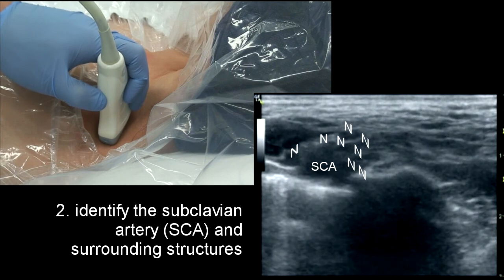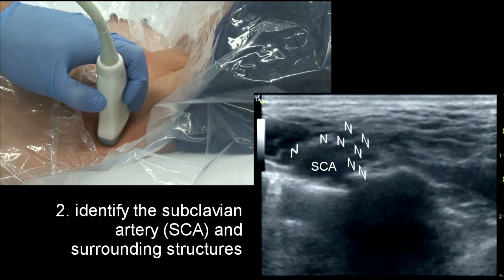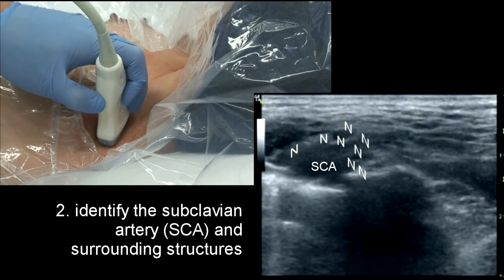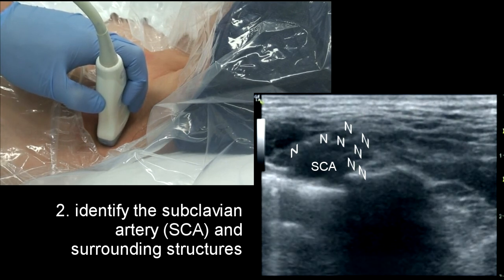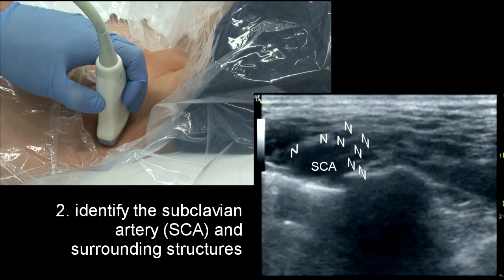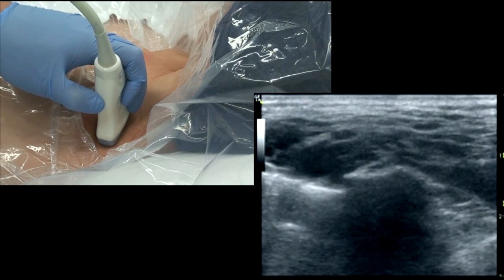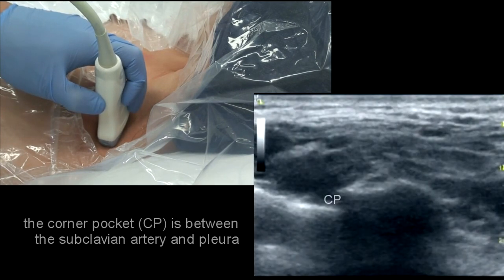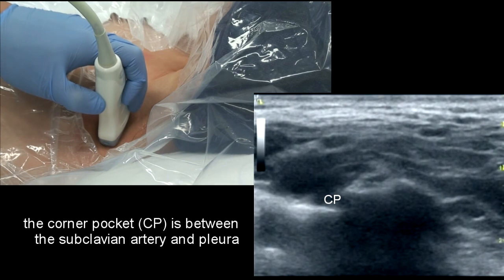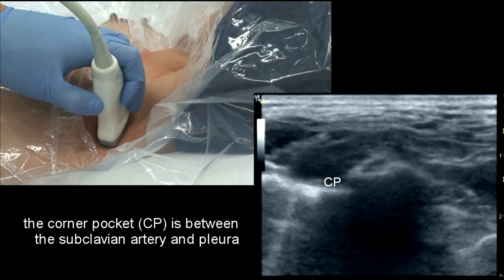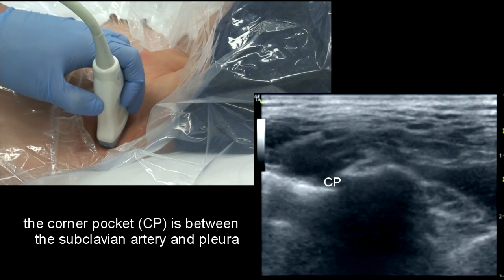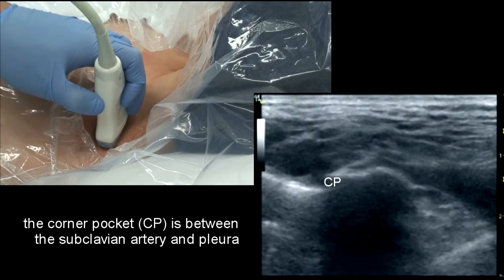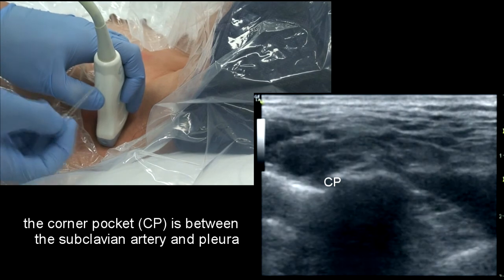Subclavian artery pulsations can resist diffusion to the lower trunk or ulnar regions. If possible, inject close to the artery in the corner pocket. This will optimise ulnar region cover.